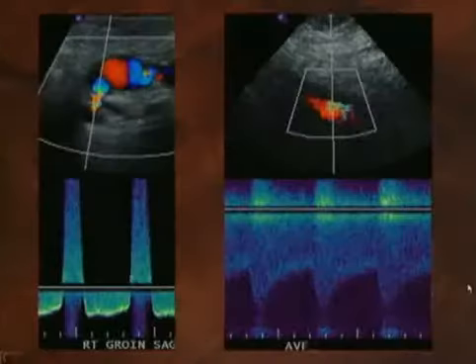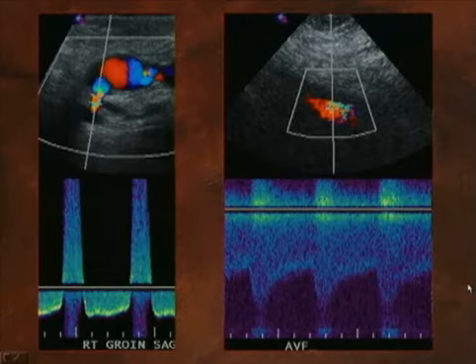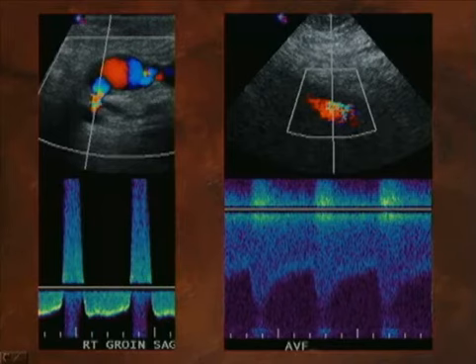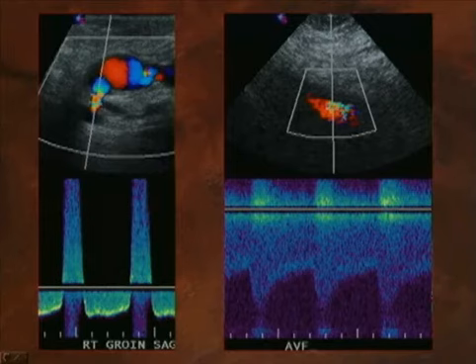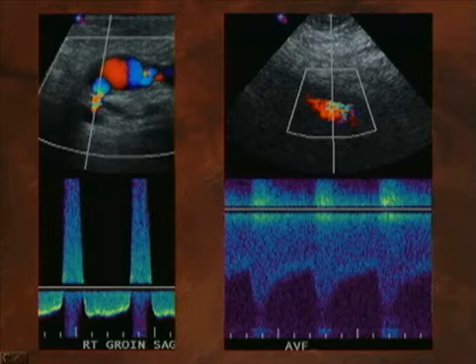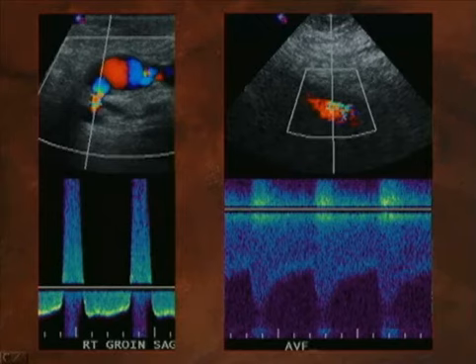Well, this patient also had another interesting finding. The image to the left shows the typical to-and-fro pattern of flow in the neck of the pseudoaneurysm, but the image to the right was obtained just slightly distal to the neck, down near the bifurcation of the femoral artery. And you can see that the flow in this area is very high velocity and very low resistance. This is a typical pattern of an associated arteriovenous fistula. And for this reason, plus the fact that the pseudoaneurysm was relatively small, the person who did this case decided not to inject the pseudoaneurysm and just wait for spontaneous thrombosis.